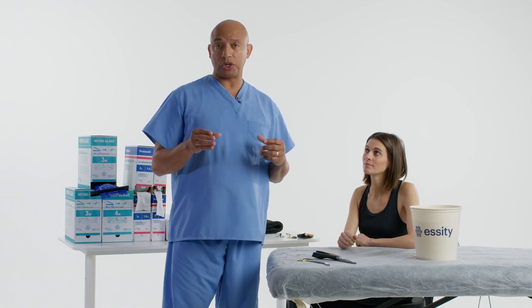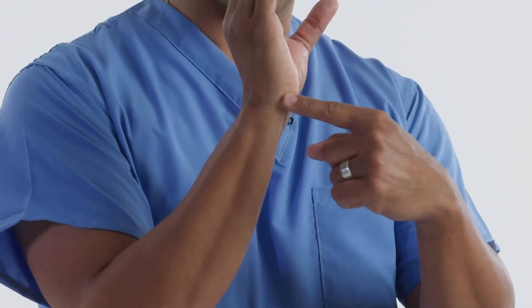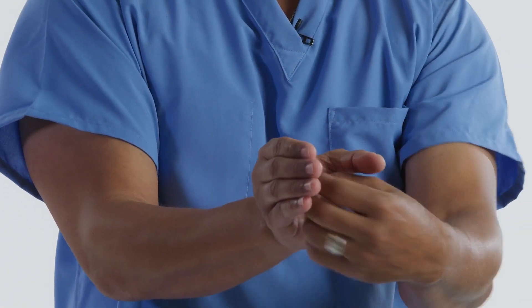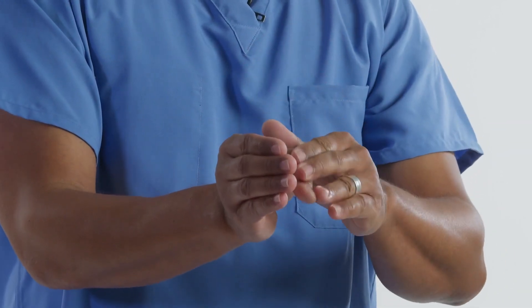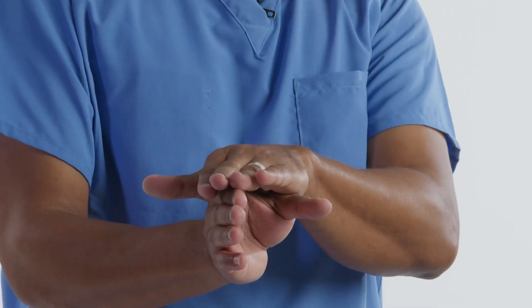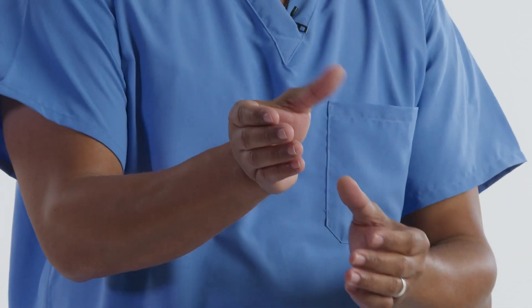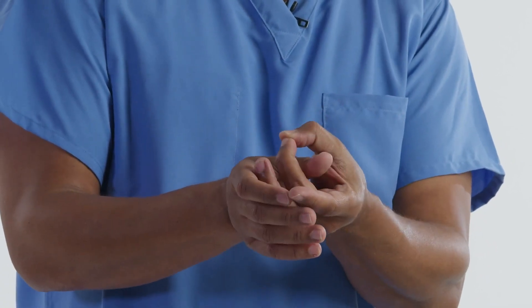So we really want to get that position right. The position we're going to get the patient in is about 20 to 30 degrees of extension at the wrist. The thumb and index finger are going to be in direct opposition, like you're trying to hold a bottle of some sort. There are injuries where you will want the thumb extended or more flexed down, but on this particular occasion we're going to have the index finger in direct opposition to the thumb. When you do a thumb spica, we want to make sure that once we cover this up, it is really immobilizing the thumb and it's not having the patient just appearing like they're doing a hula hoop.